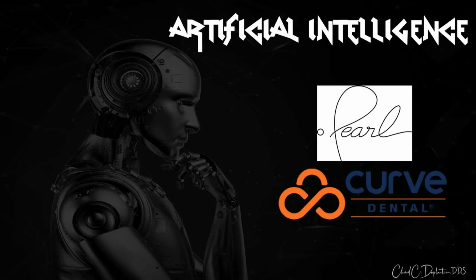Over the past few months, we've definitely heard a lot about artificial intelligence through social media and just its role in society. We know that a number of companies are incorporating artificial intelligence to take over duties that humans once performed within that organization. Some of us see it as a detriment, others of us see it as a great benefit to society. But in dentistry, I can tell you it's incredibly beneficial to our diagnostic workflows as well as our patient education portfolio that we have in our practices.